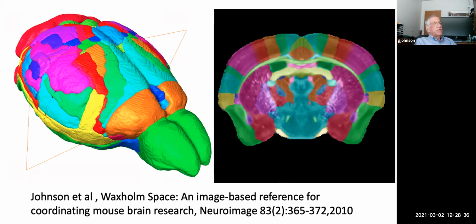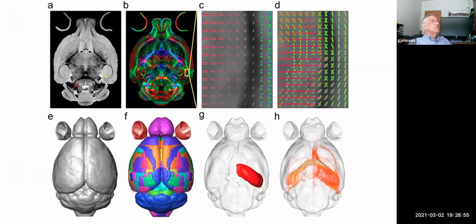We will take a population of 10 or 20 animals, throw them into the cluster, and it will take 3, sometimes 4 days to do the diffeomorphic and affine transforms that are necessary to get these mapped. But it can be done, and it can be done in a routine and standardized fashion. When we do that, then the pipeline allows us to do the following.